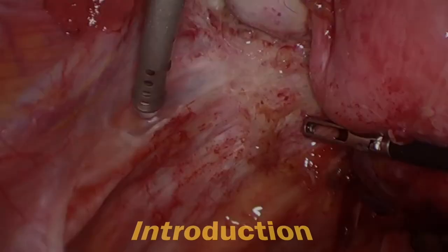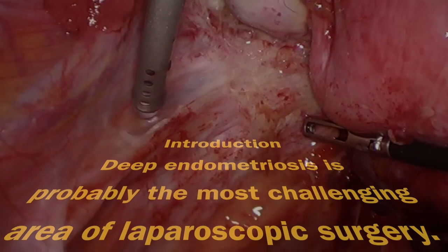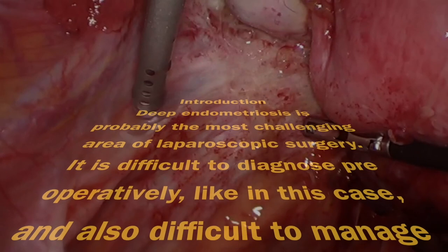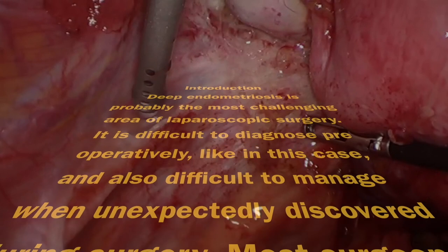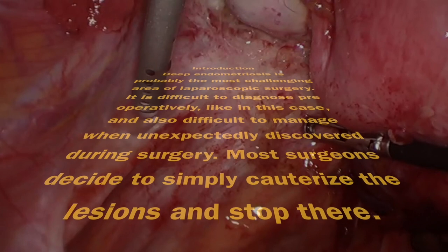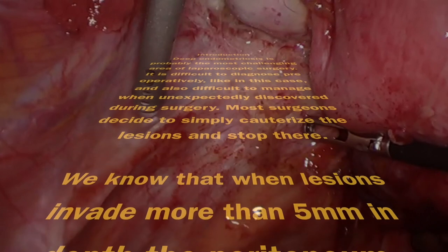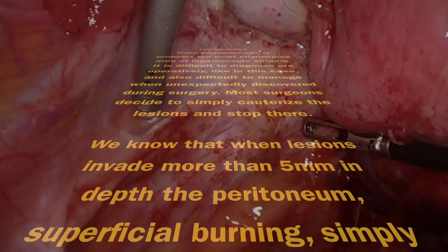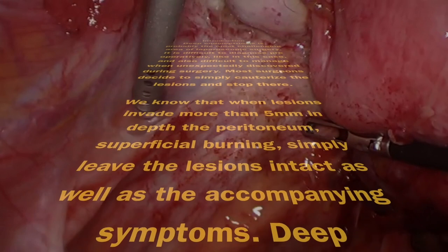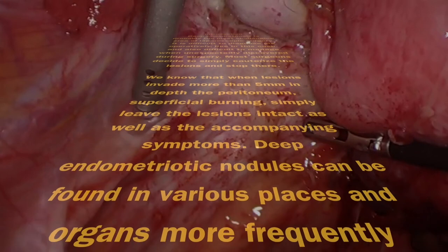Deep endometriosis is probably the most challenging area of laparoscopic surgery. It is difficult to diagnose preoperatively, like in this case, and also difficult to manage when unexpectedly discovered during surgery. Most surgeons decide to simply cauterize the lesions and stop there. We know that when lesions invade more than 5mm in depth into the peritoneum, superficial burning simply leaves the lesions intact, as well as the accompanying symptoms.